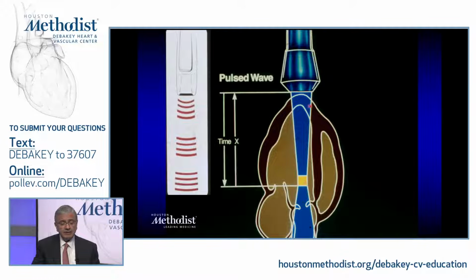So we listen again when it comes back at that level, and we listen for the frequency shift that has occurred. So if this is the transducer at 3.5 megahertz, we'll wait a little bit and listen to that frequency shift.